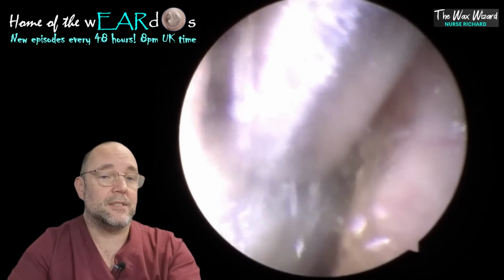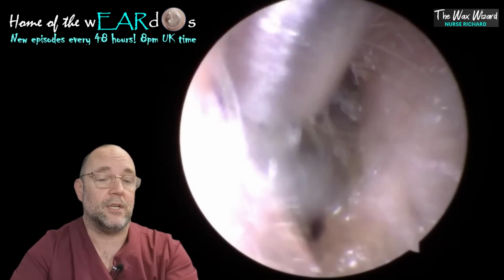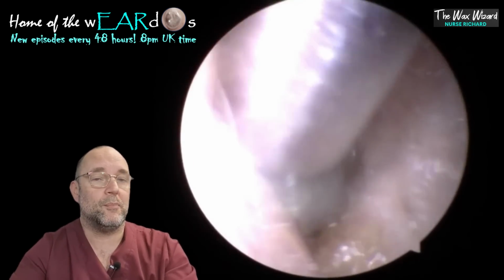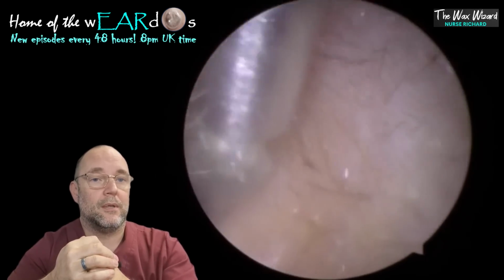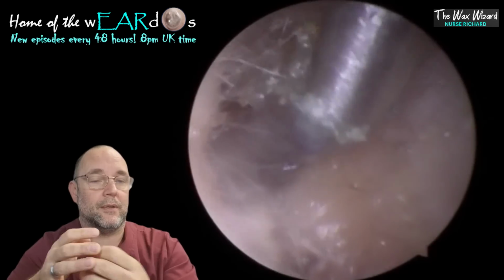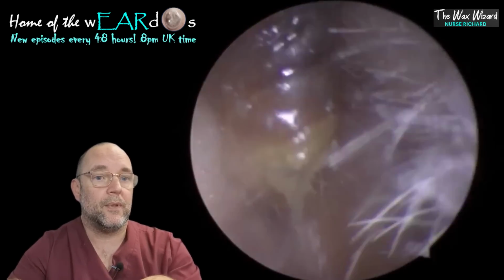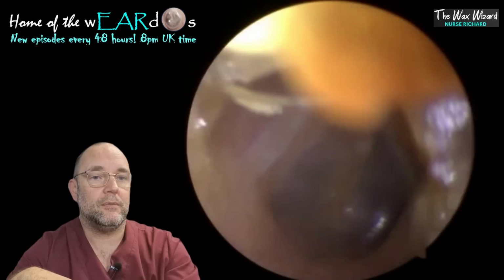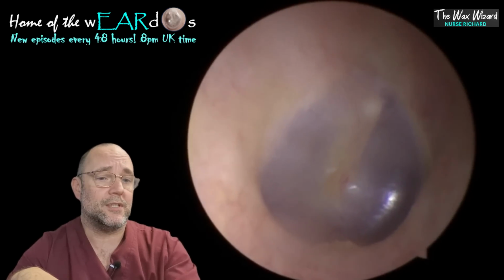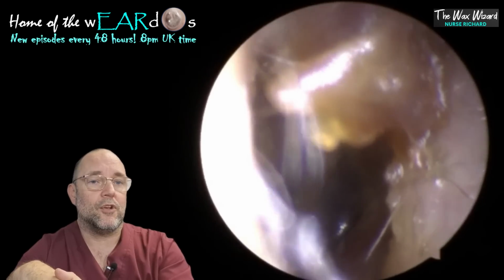And that's the old equipment I was using actually, and I don't know if you can tell the difference, because I've got both sets of monitors used in this. The monitor on the endoscope that we record these videos from. The first procedure you saw, that was with the newer one. These last 4 are with the older one. So you can probably tell the difference. Don't get me wrong, you can still get decent images on the older one. You've just got to work a bit harder for it sometimes, fiddling about with everything.